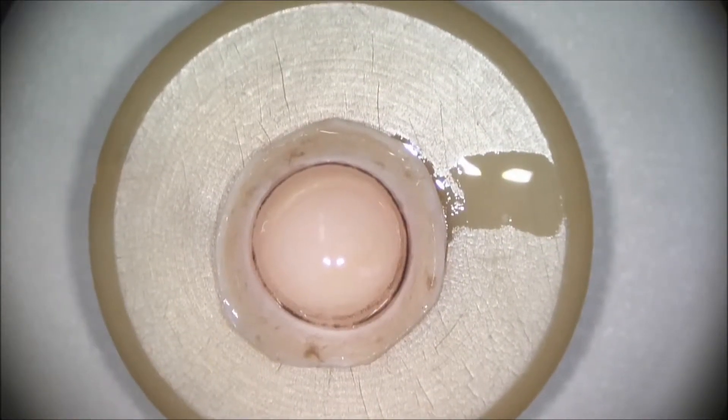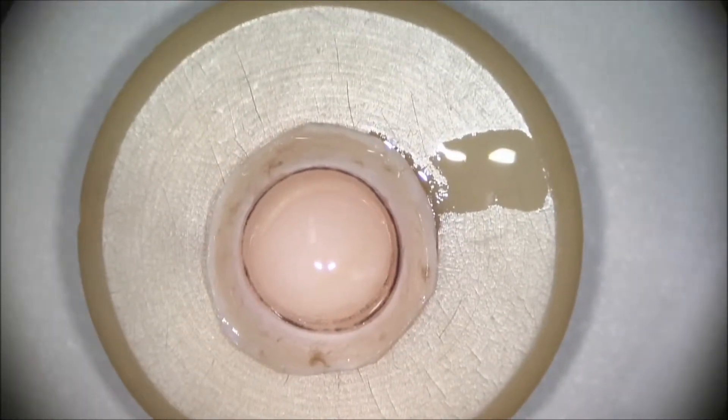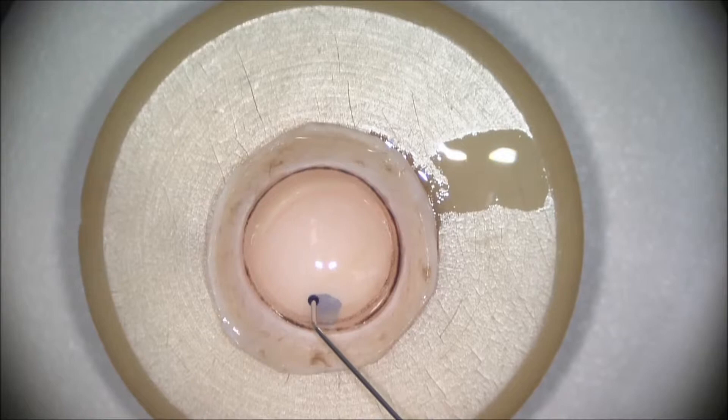So here we have our donor graft, and we start by staining it with trypan blue.